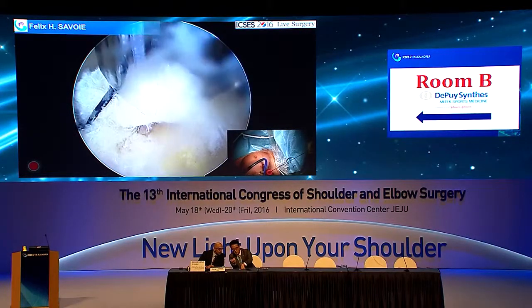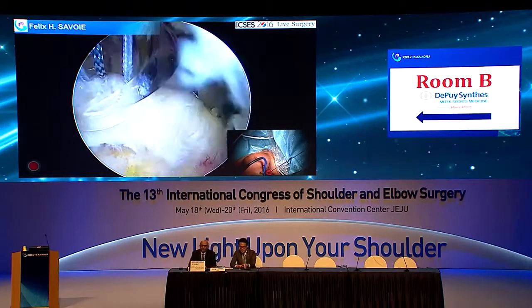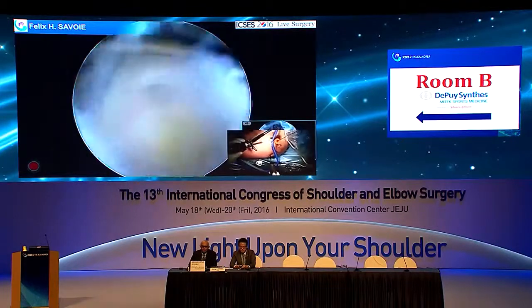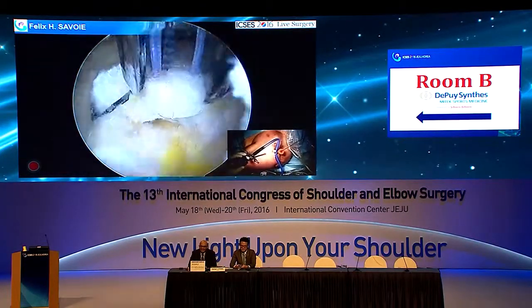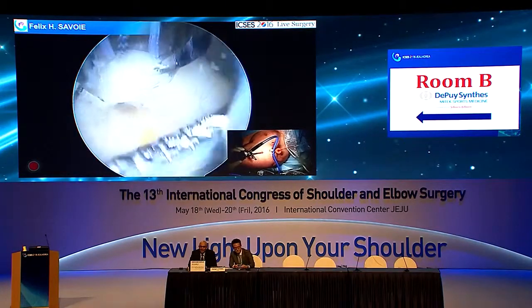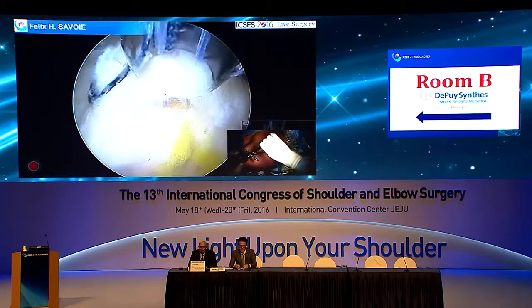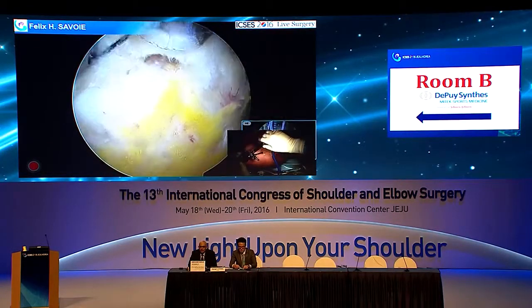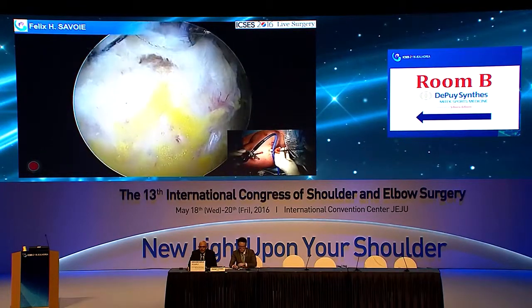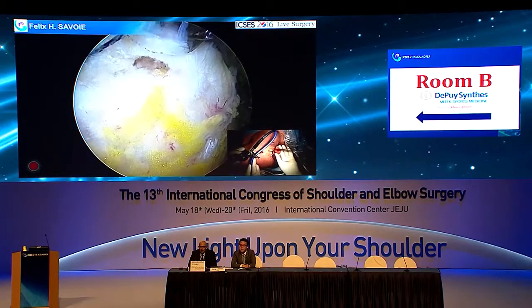Let me clean this up a little bit so they can see better. I think we're going not fast enough. We have a little bit of extra swelling over here. See? So that means I'm going too slow. Okay, now we can see better. See, it's a better picture. So I'll come here. You come here. Okay? Oh, no, this first. Oh, I have to change cannulas, right? That won't go through this cannula.